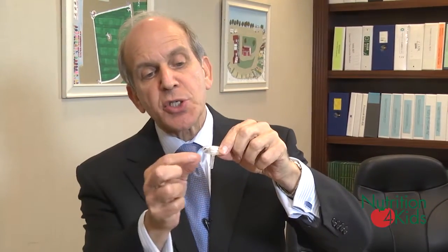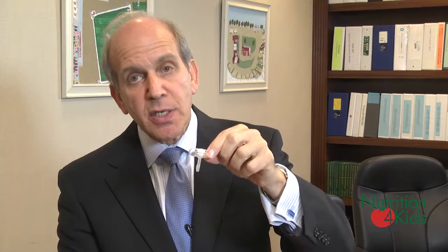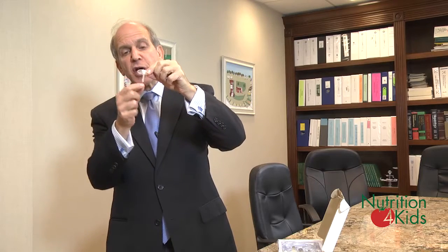We have above it the tube that can be used directly. We can then insert the different types of tubes into this button, and it then functions essentially like the original gastrostomy tube that was there. The end attaches to either a syringe or to a tube delivering formula from an IV bag-like device that allows it to drip in slowly through a pump that determines the speed at which the formula is delivered. Once inserted, this is simply the only tube in the baby's abdomen, putting nutrition just inside the stomach.